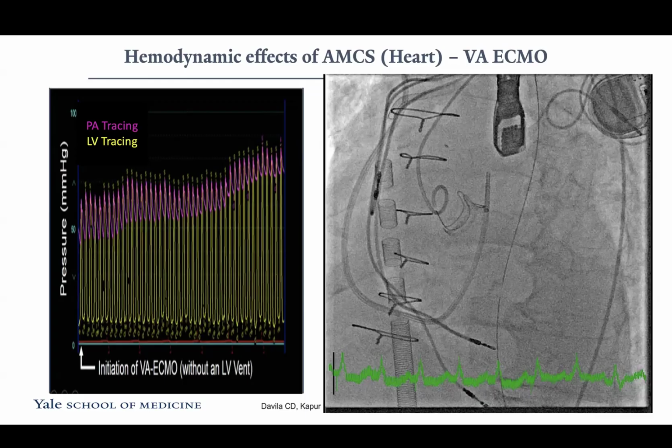Do you think that that's a reason that we have so many strokes? Yes. So there are two hypotheses. That one is one, and the other one is the hyperoxia.